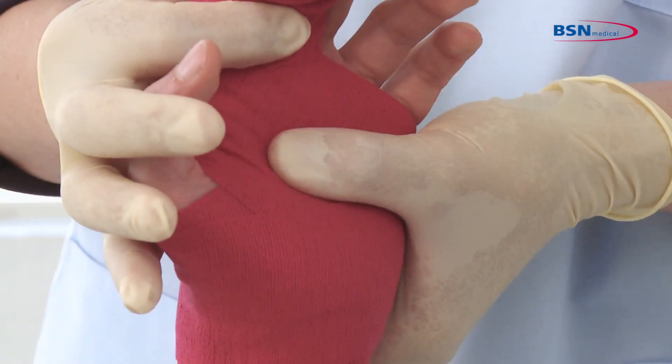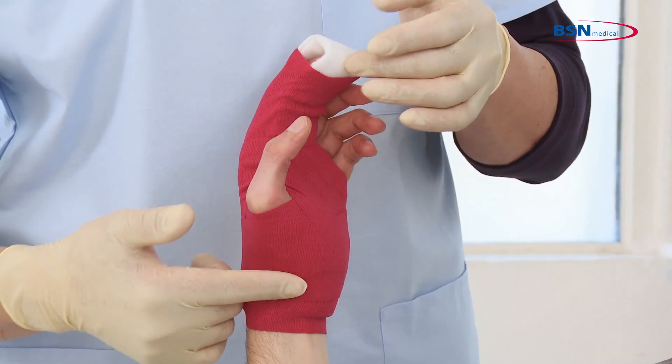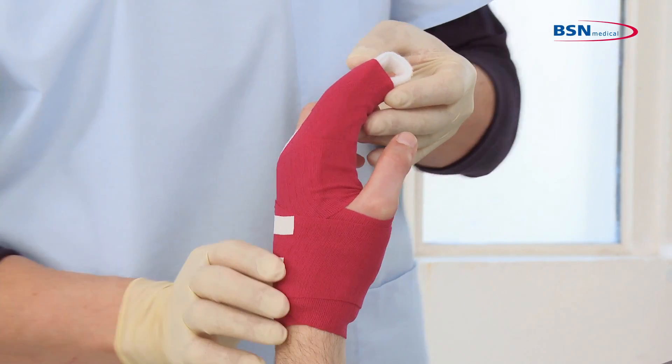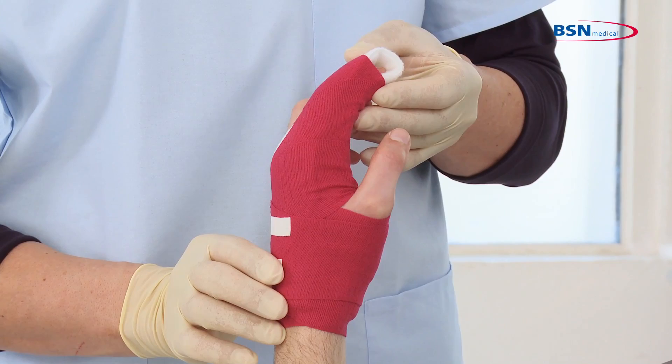Normally you flex metacarpals to 45 degrees and the wrist to 20 degrees extension, then tape down or treat as prescribed by the physician.